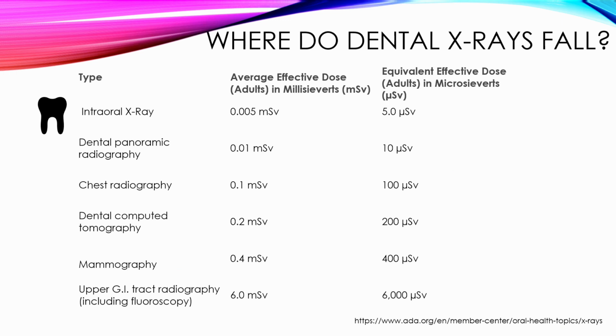When you take x-rays on patients in a dental office, there will be times when you get pushback from a patient that doesn't want x-rays taken. This response comes from the fear of excess radiation, which is not invalid. We know that radiation can cause harmful health effects. What the patient might not understand is that we are exposed to radiation every day, from radon in the soil to cosmic rays from outer space, nuclear testing. We live in a biodome. The world is like a snow globe. Whatever happens on the other side of the world can affect us indirectly here.